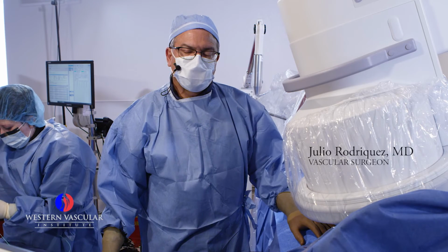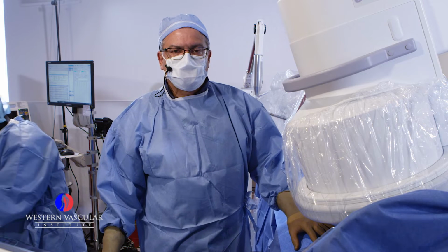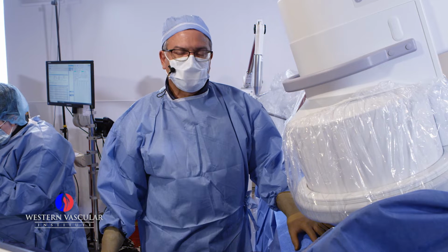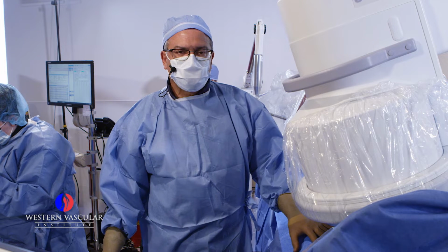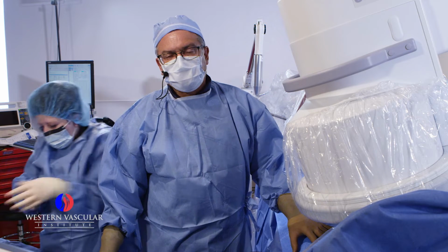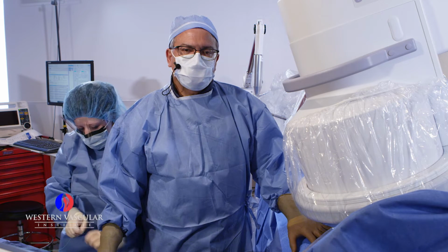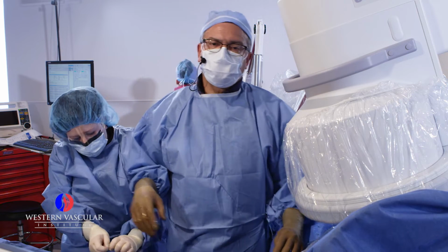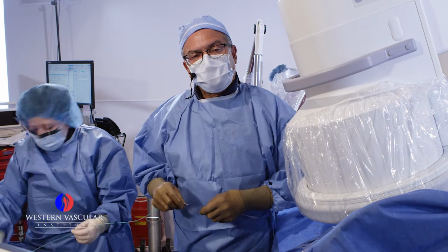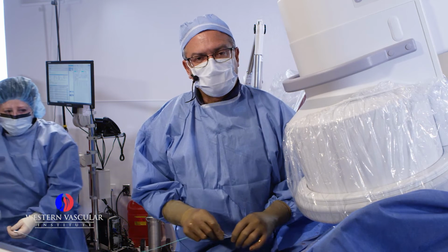Hi, we are in the angio suite, and we have an interesting case this morning. This lady is in her late 70s, and she presented to us with a long-standing history of vascular blockages in the legs. This is an example of how plaque and atherosclerosis disease can affect the circulation of the leg and make the patient suffer from difficulty walking, and pretty much go around during the day doing just basic activities.